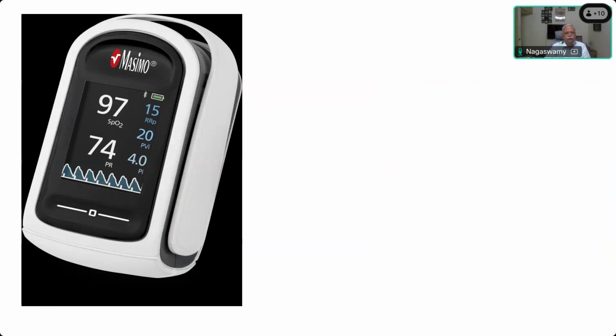It is perfusion index. Pleth variability index. Pleth variability index was present even earlier, but this eliminates some of the artifacts like motion artifact, ambient light artifact, position artifact, and then temperature artifact.